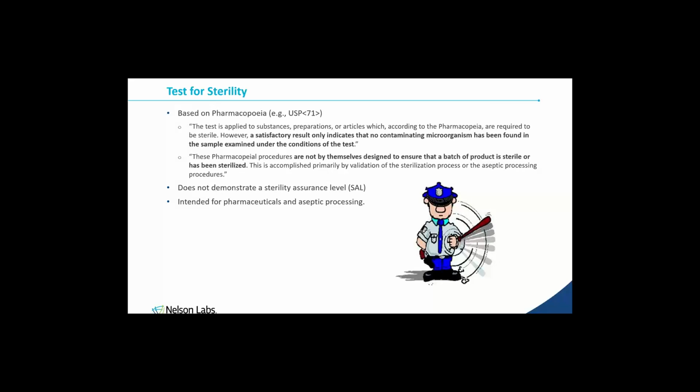So let's talk about test of sterility, test for sterility. Terminology is something that really matters within the industry. The breakdown of a sterility test is that there is a test for and a test of. So what's a test for sterility?